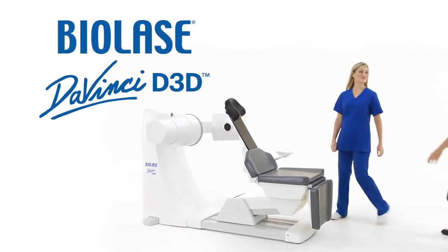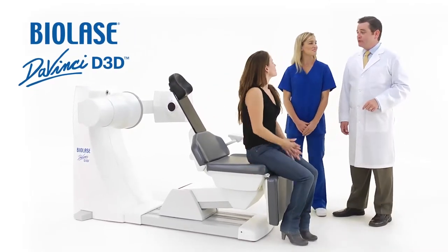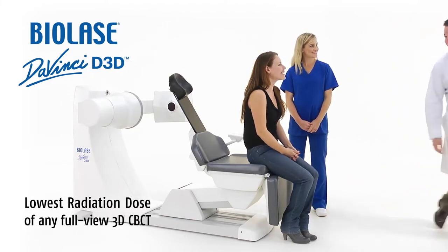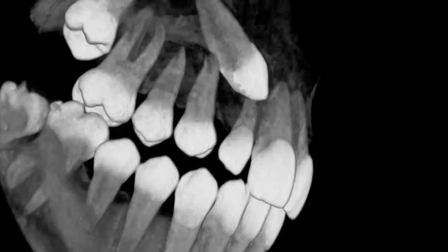Now we've brought the same biological dentistry approach to diagnosis in the BioLase DaVinci Imaging D3D. With the lowest radiation of any full-view 3D cone beam CT system, the DaVinci Imaging D3D generates high-resolution 3D images with one of the lowest radiation doses of any cone beam system available.